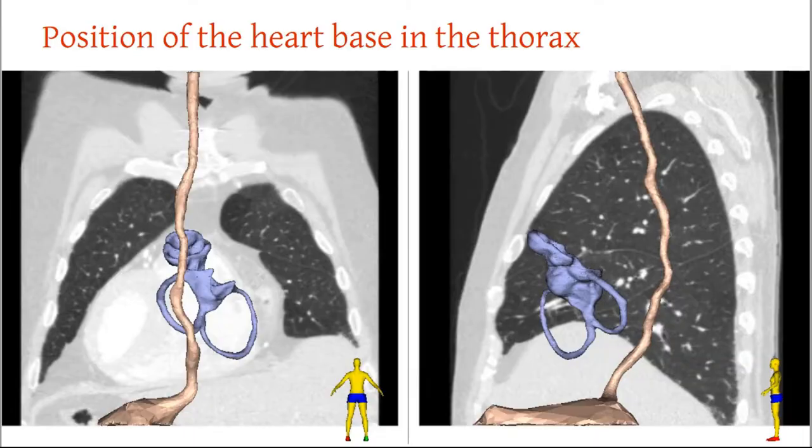Okay. Now this is the most important view. This is the posterior view from the perspective of the TE probe. So that's going to be coming down the esophagus. So down here is our mid-esophageal window, because the left atrium is going to be right behind the mitral valve.